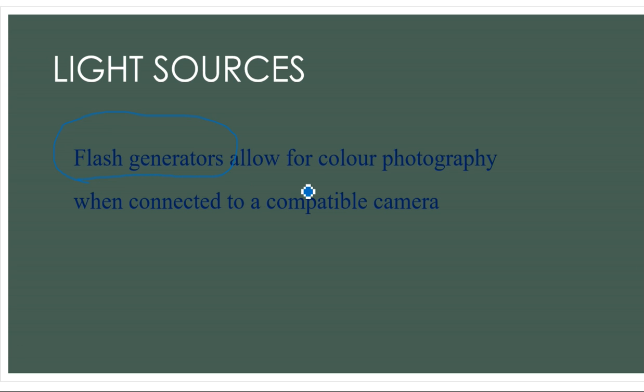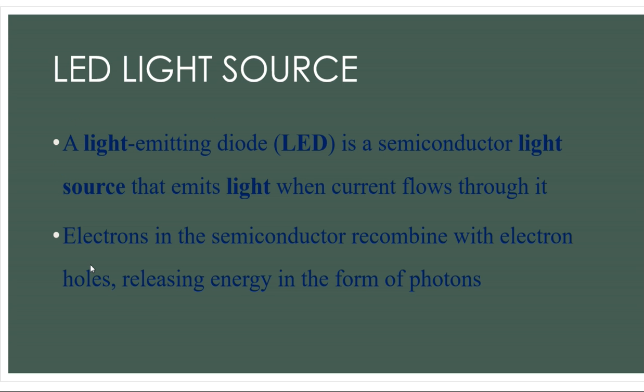These flash generators allow for color photography. We can take the pictures while operating whenever we want, when it is connected to a compatible camera, right? So this facility is also available. With the present day light sources, we can take the pictures by manually controlling it.